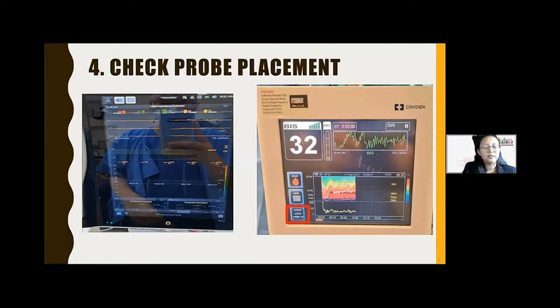To troubleshoot this, you will have to press more firmly across the points which show up as trouble spots, and then you check whether or not your probe is placed well again.